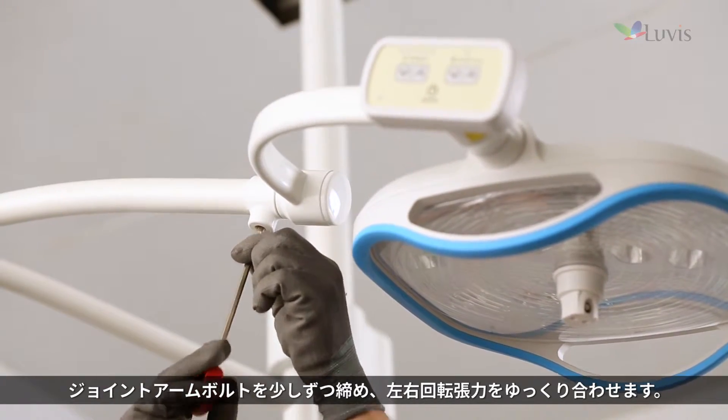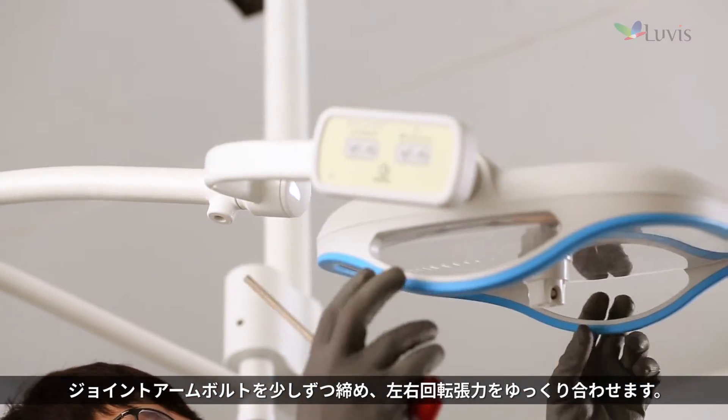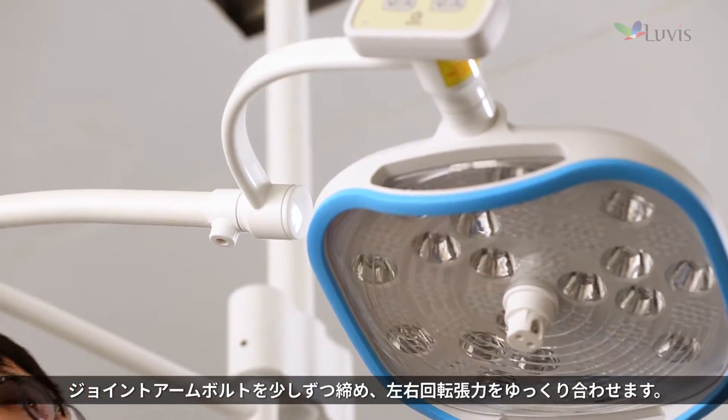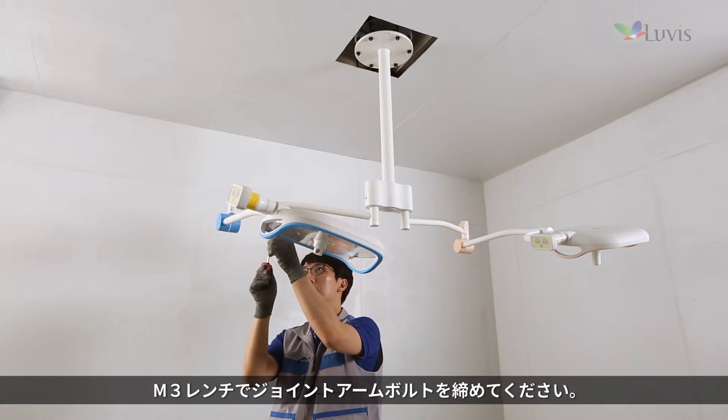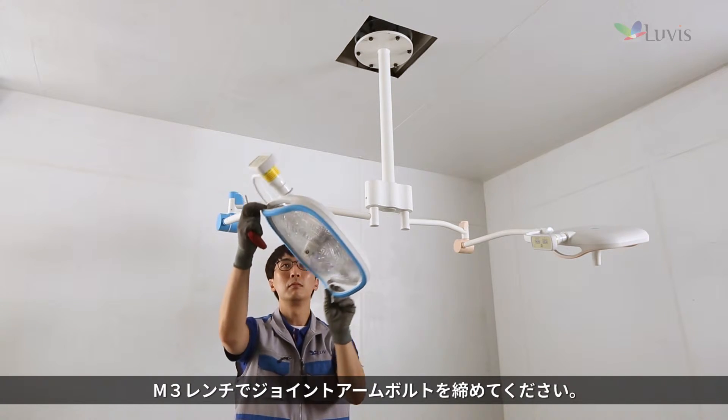Adjust the right and left rotational tension smoothly while tightening the joint arm bolt gradually. If the head assembly slips without being fixed during operation check, tighten the joint arm bolt using the M3 wrench.